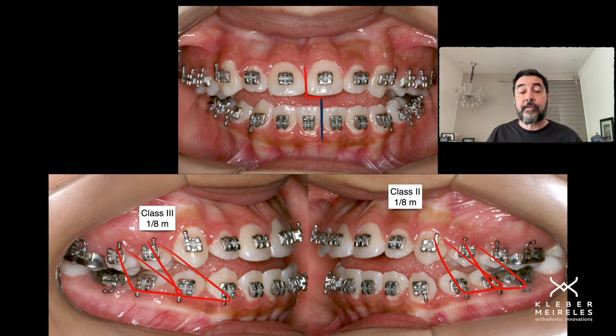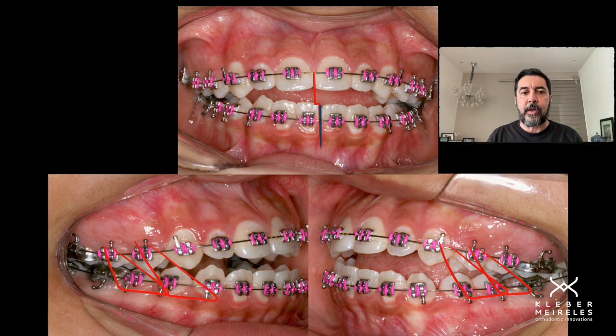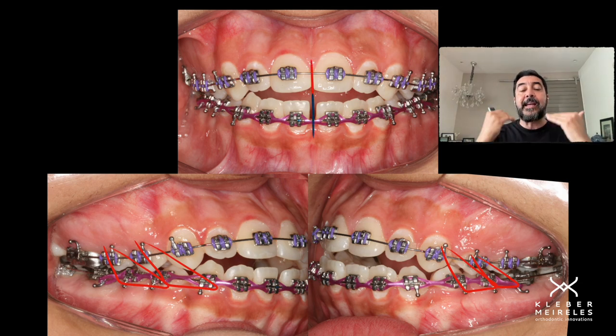On the other side it's quite the opposite because the midlines were shifted — one to each side. So in this case, class III on one side and class II on the other side. We keep going with the same thinking, without the need of putting elastics in the anterior segment, which is very difficult because it loses patient compliance as it's too exposed. Placing the elastic in the posterior segment gives us more patient compliance.